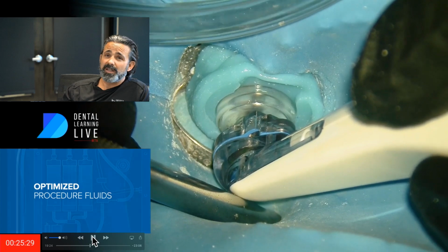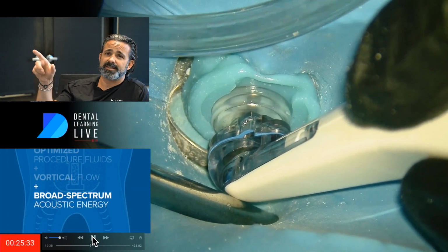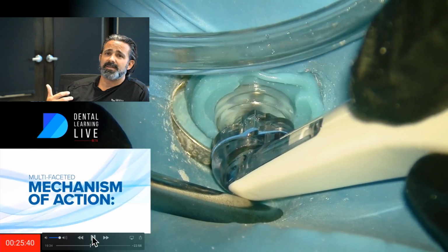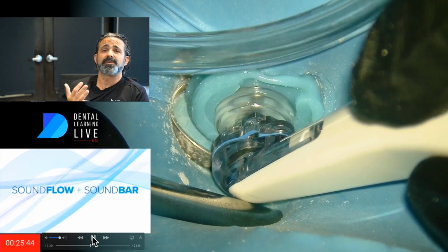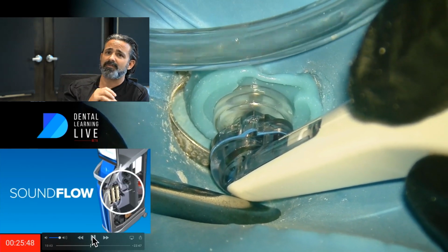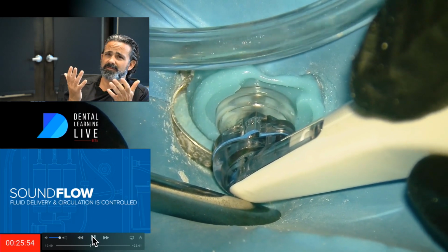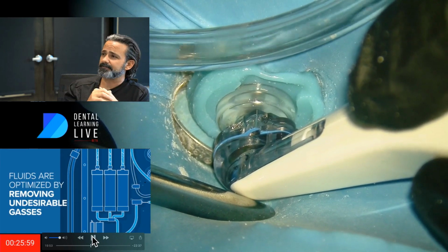But what I'm really looking at, we all look at different things on the screen, is that cap. And I'm watching whatever comes out. At times, you can see farm animals come through there, kidding. But you can see purulence, maybe some sealer, or gutta percha rather, that popped off a wall. You'll see that kind of flutter up through in these retreatment cases. Or in vital cases, you'll see tissue or heme, things like that.